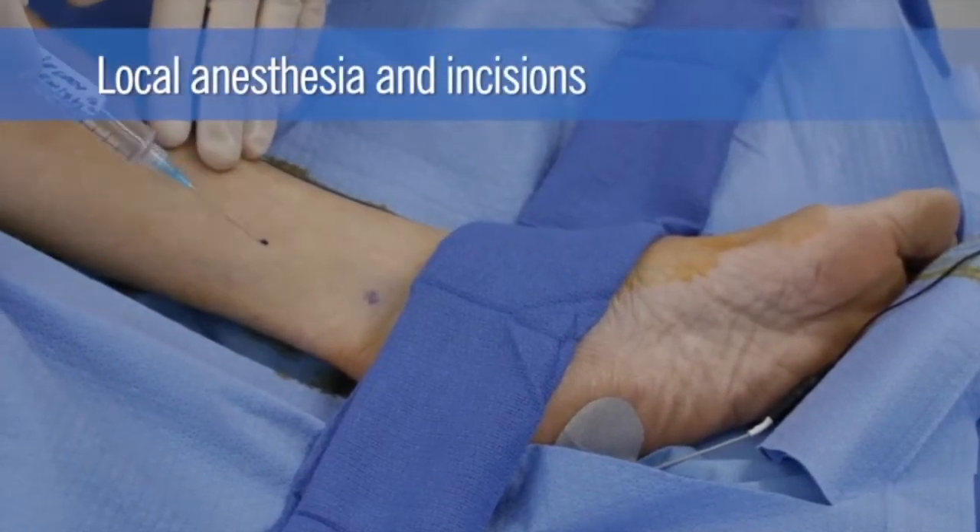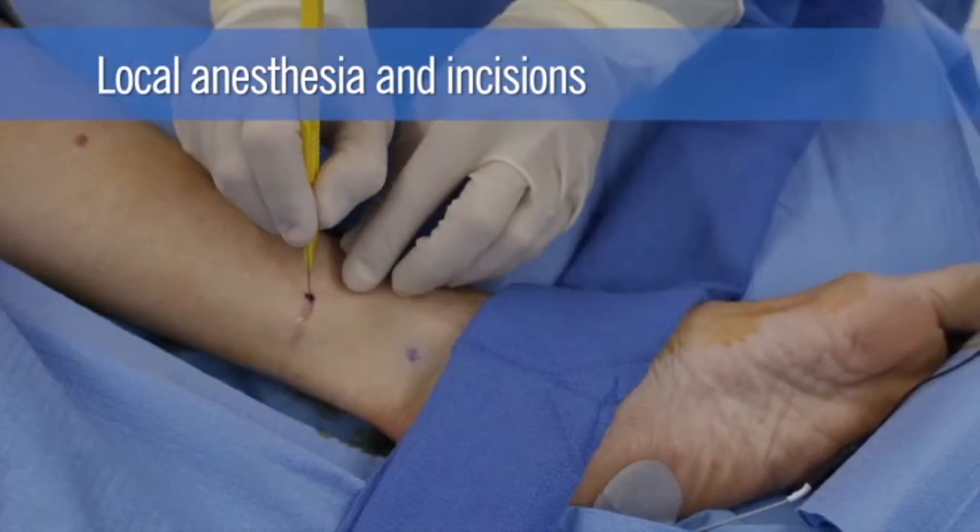At the site of the proximal marking, 1% lidocaine is injected and an incision is made.